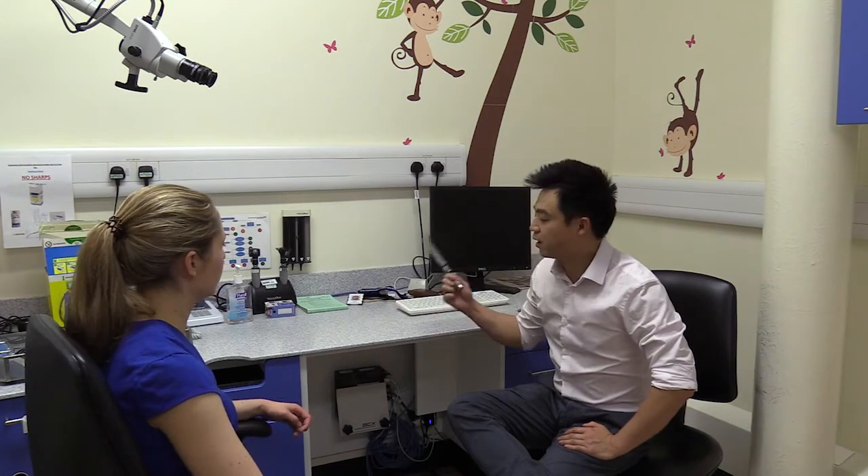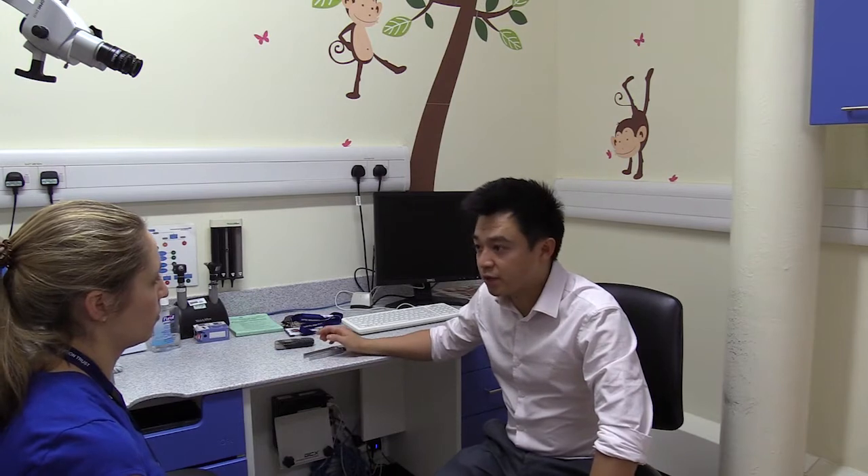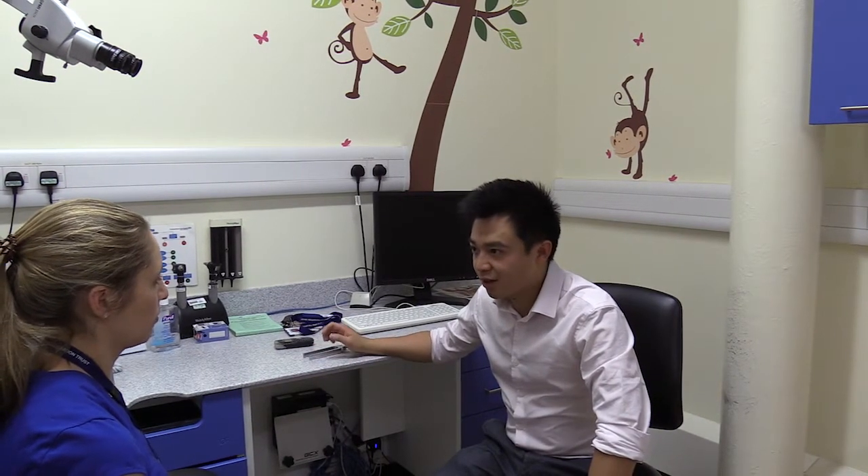We're going to do some hearing tests now using a tuning fork. I'm going to present to you two sounds — sound number one and sound number two — and I'd like you to tell me which is louder.